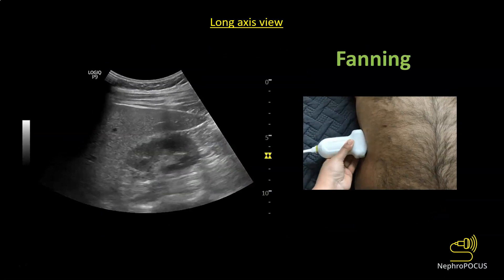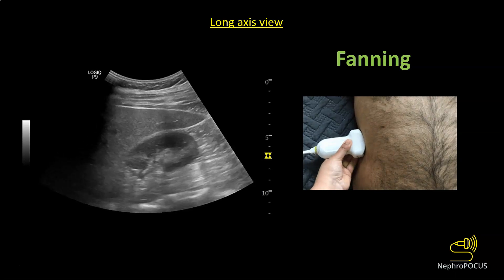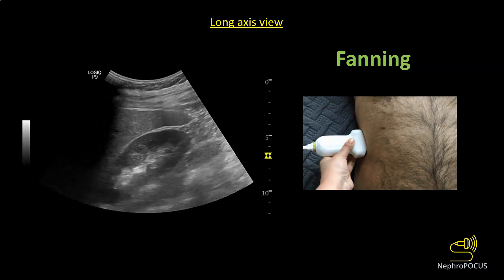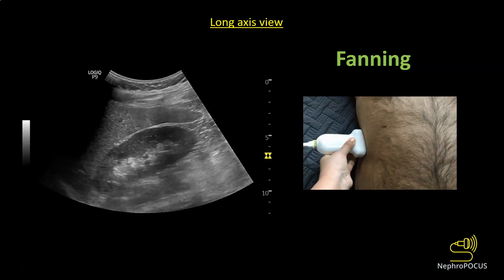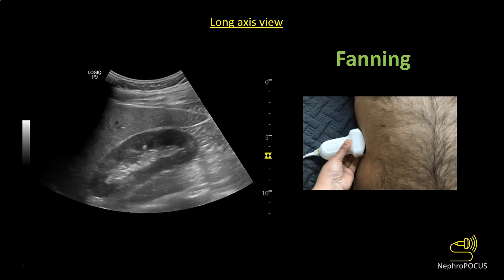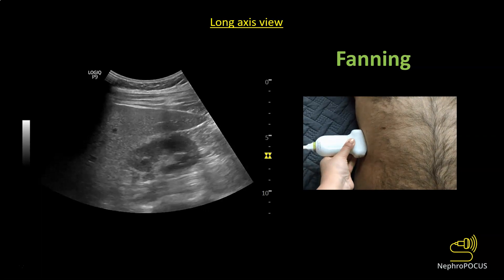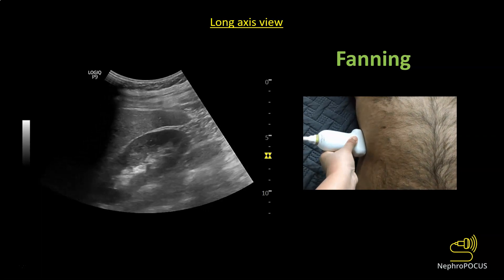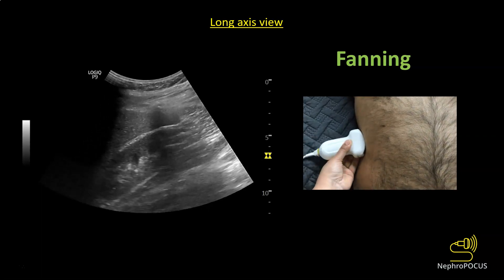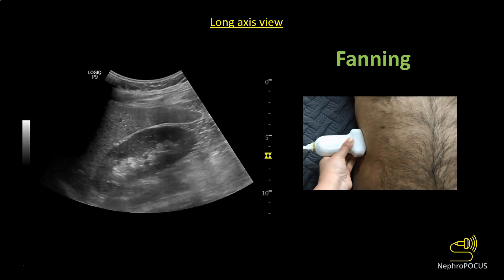Once you find the long axis view of the kidney, fan the transducer anteroposteriorly so that you visualize the kidney in its entirety and do not miss any small lesions.